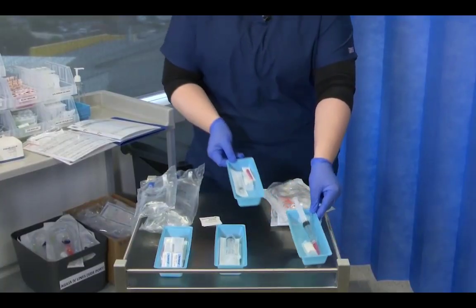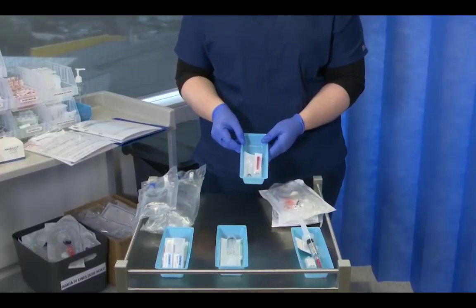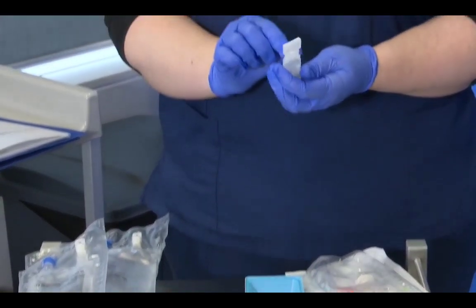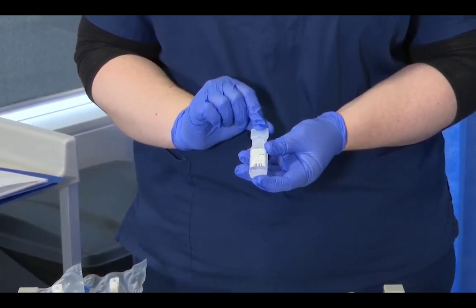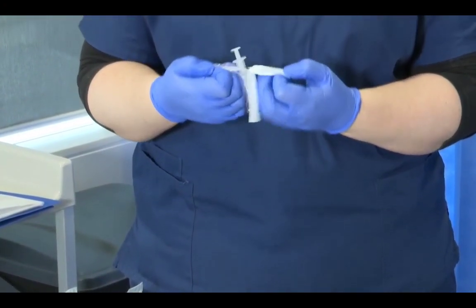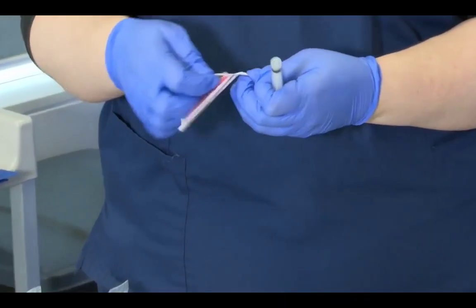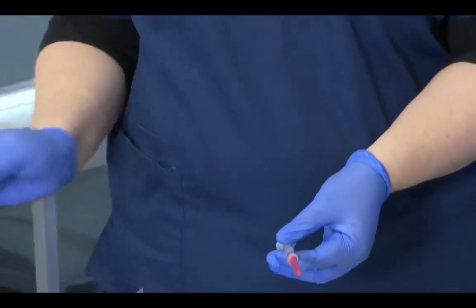Next, we're going to do our 3 ml priming solution. Again, nothing can be in our tray, and we have our second check of sodium chloride 0.9%, 10 ml, expires 2025. We open our 3 ml syringe. We open our red needle and luer lock it on.